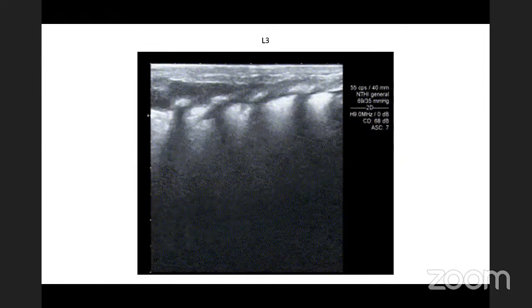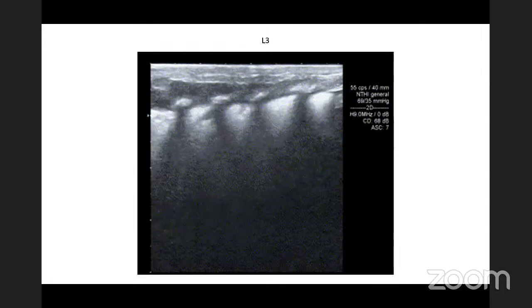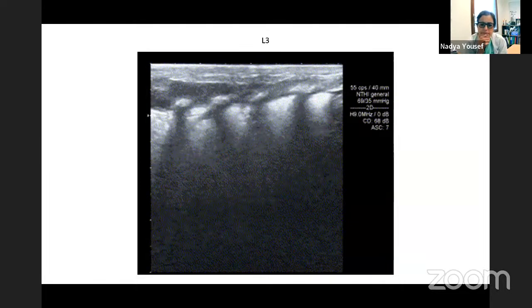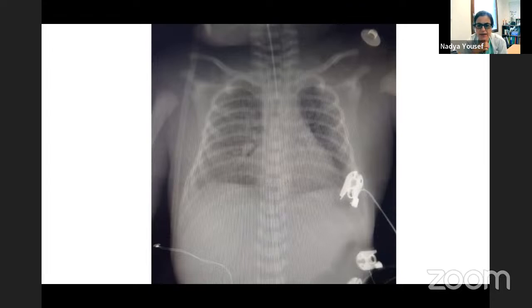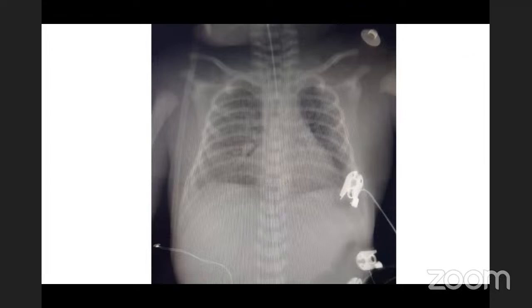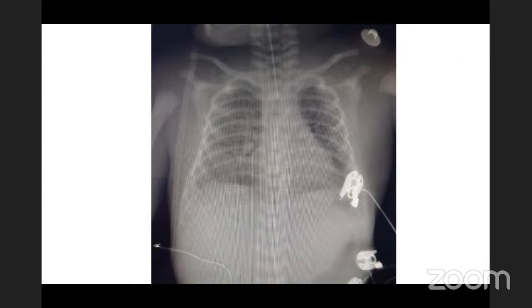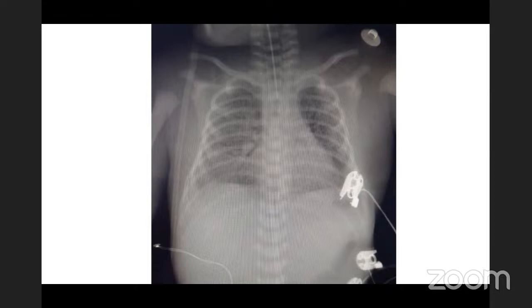My interpretation was this is pneumonia because of the consolidations, but I am also thinking about surfactant deficiency. So maybe both components. You mean complicated RDS? Yeah, RDS. And were there any inflammatory parameters or anything? I missed the part about the infection, I think. There was a urinary infection in the mother.